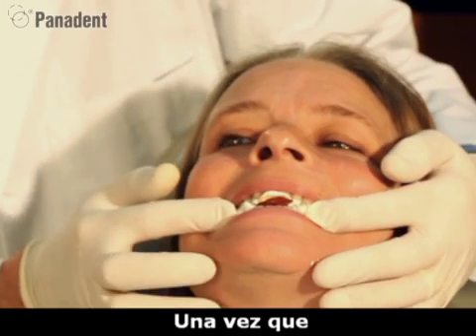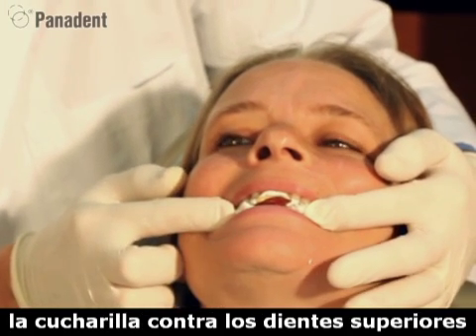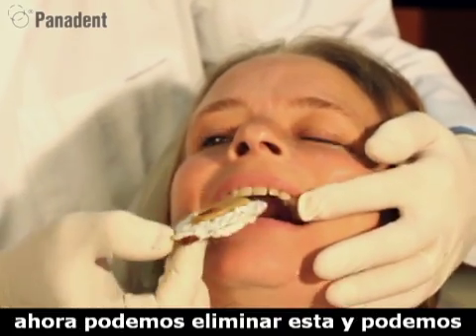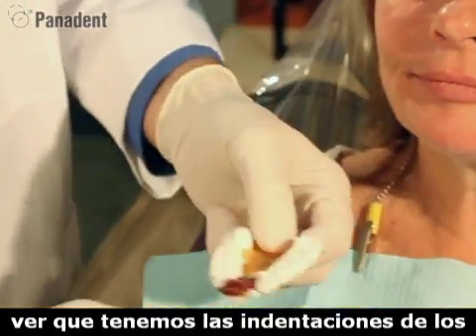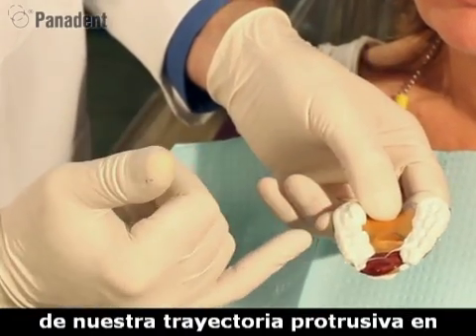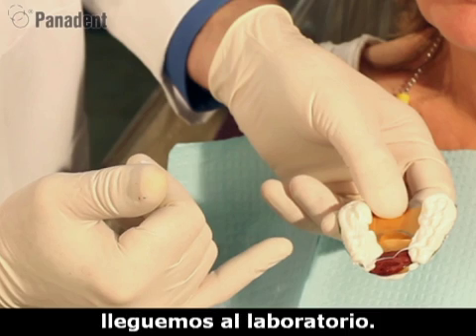Once the material sets, again, you just hold the tray against the upper teeth, have the patient open their mouth, which separates it from the bite tray. We can now remove this, and we can see that we do have indentations of the posterior teeth for programming our protrusive pathway into the articulator when we get to the laboratory.